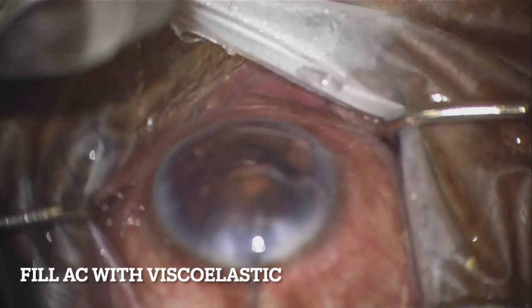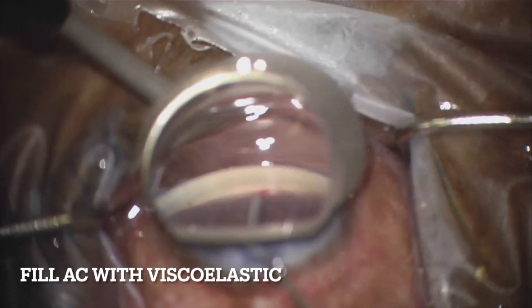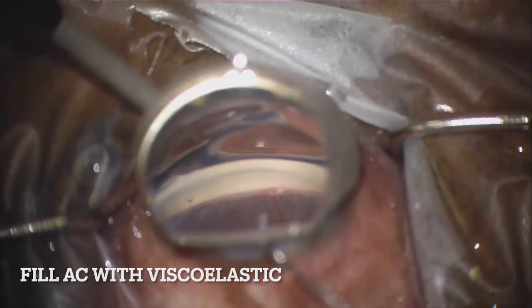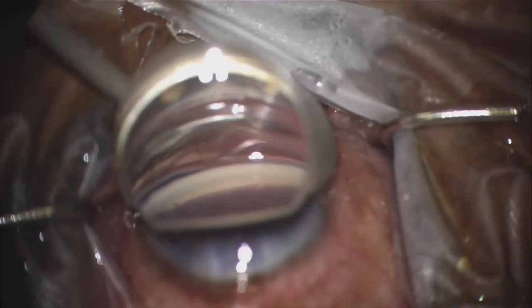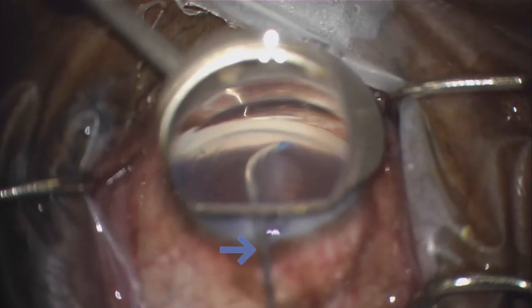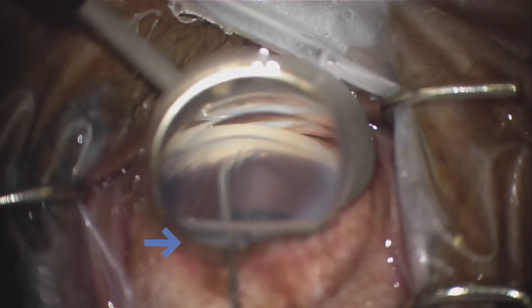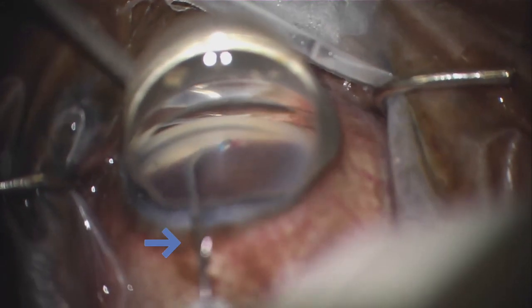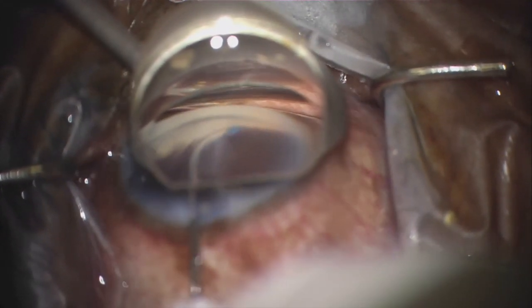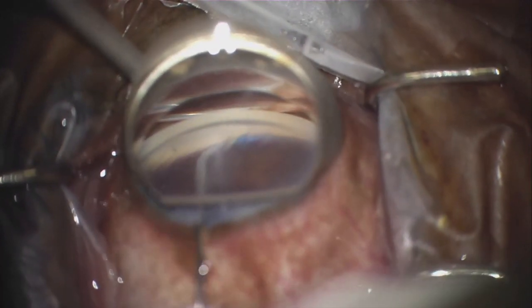One suggestion is to fill the AC with viscoelastic right before the entry of the Omni and in between passes of the inferior and superior angle if more than one hemisphere is being treated. Also, mind your dominant hand and try to keep it lifted up so as not to create significant loss of viscoelastic from the corneal incision, which depressurizes the AC and contributes to corneal striae.